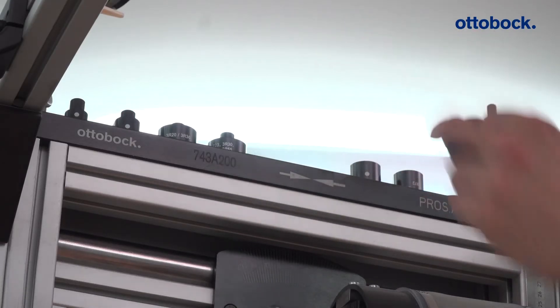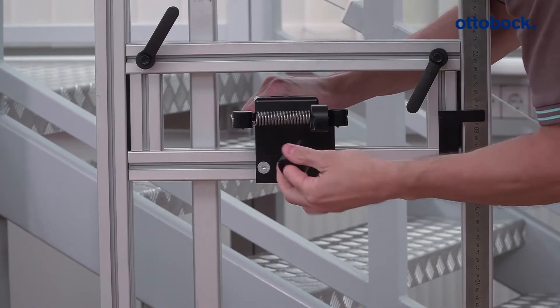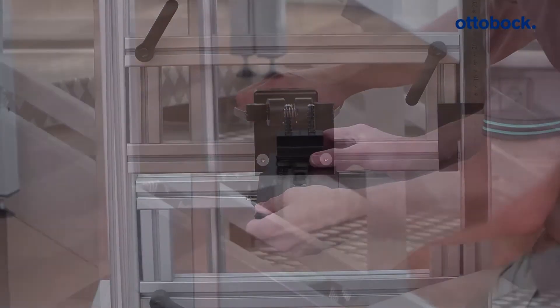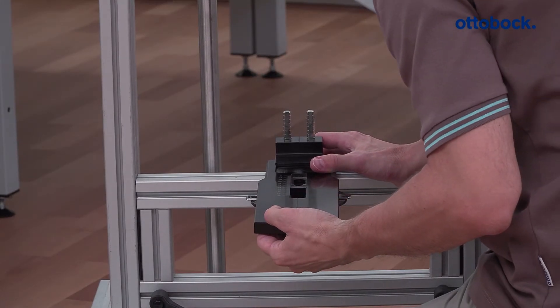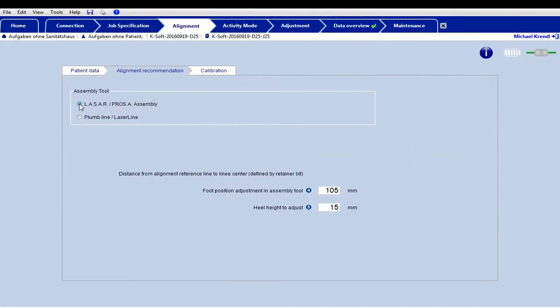If you are using the PROS A assembly, the required settings such as the prosthesis side, heel height, and foot turnout should be carried out using the alignment tool. Follow the alignment recommendation for the knee joint and the foot in Ksoft.